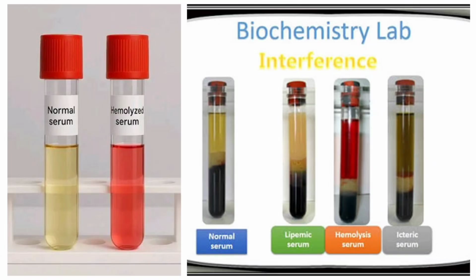I think I'm already getting close to answering this question. So let me go again. We calibrated using this serum. What it means is that when you analyze something that is hemolyzed like this, you should expect that the interference of this hemolysis would impact negatively and give you a false result, even if that false result is outside linearity or within linearity.